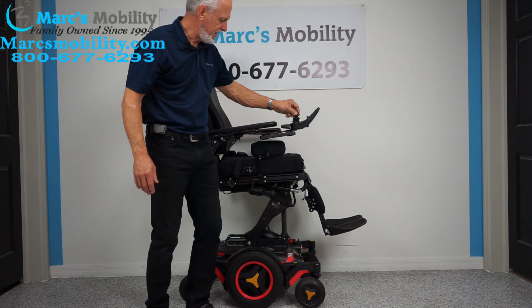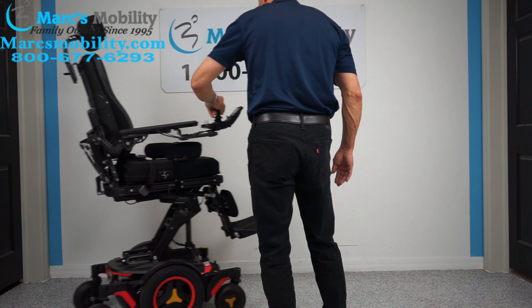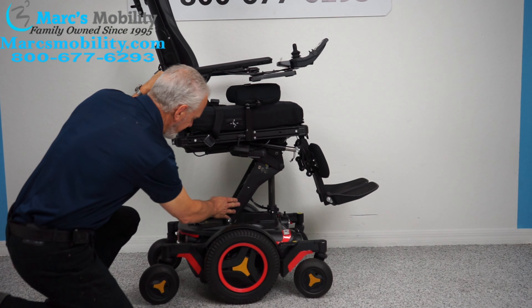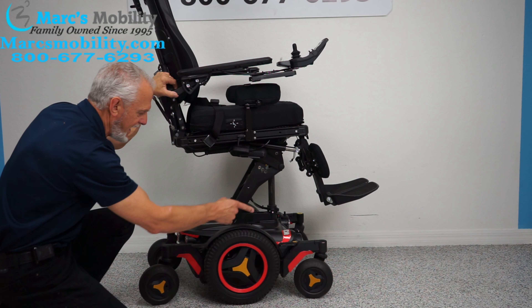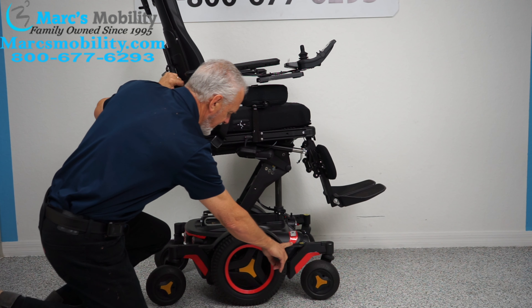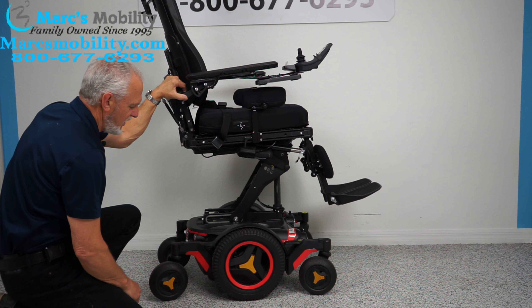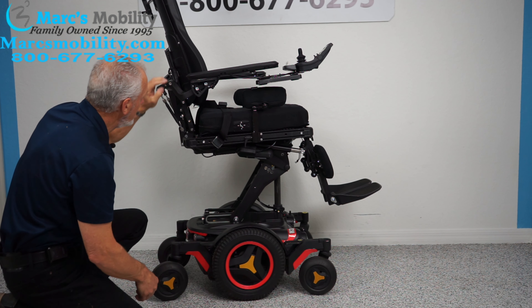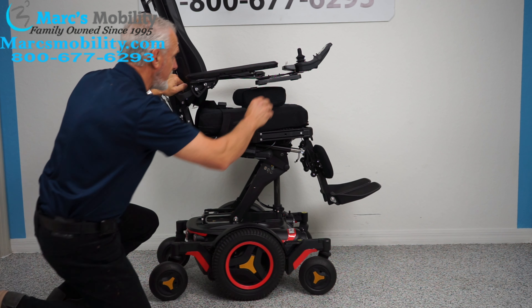Once the seat is elevated, you can still drive these chairs at a decent speed in your house. Looking at the base, you can see the armature for the seat lift. There are 14-inch solid wheels that will not mark your floors, solid caster wheels in the back and front. There are anchor points here — this is where you secure your chair to your lift or van for transportation, two on each side. There is also suspension with a large shock behind the wheel.